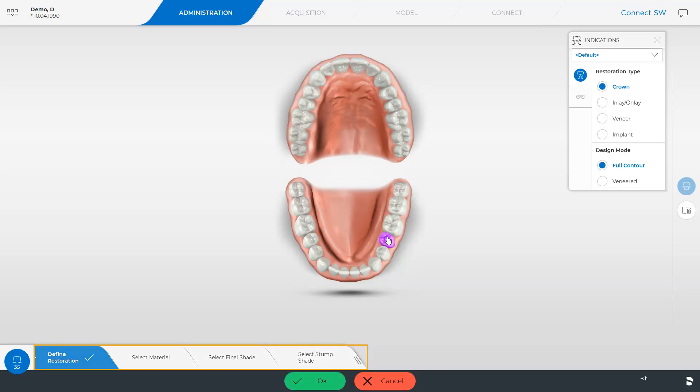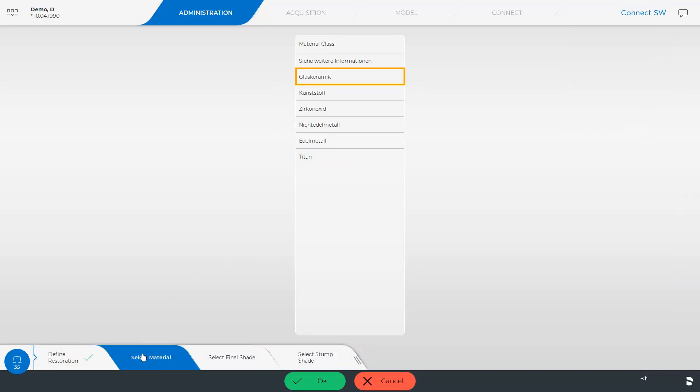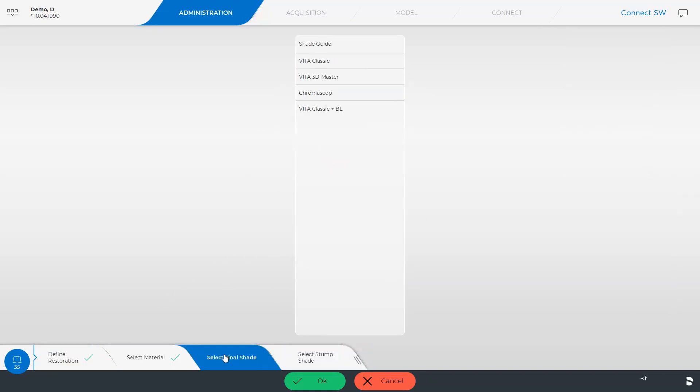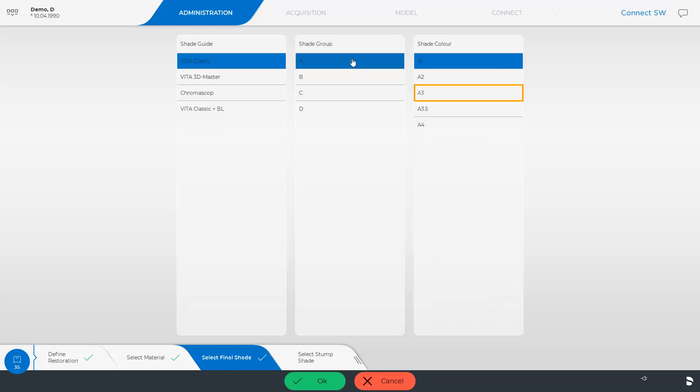Alternatively, we can run through all steps of the step menu if desired. In this way, we can define the material and the color of the restoration or the stump. We end our selection at this point and confirm with OK.